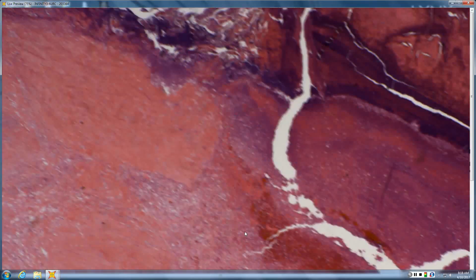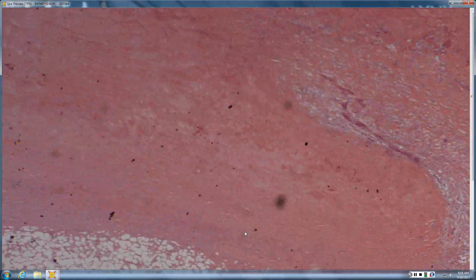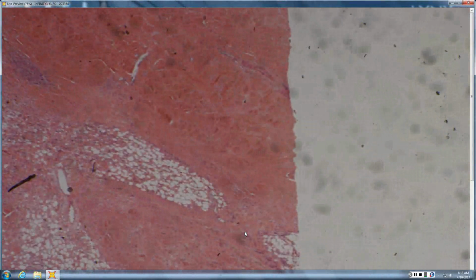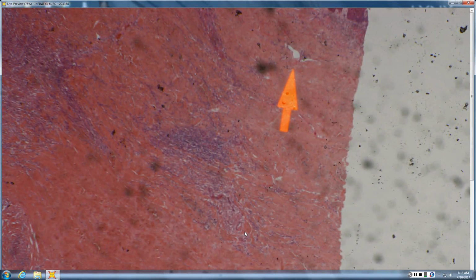So we've got a big ulcer, right? And then the question is, is anything in the background what may have caused the ulcer? So let's look at the adjacent skin. You've got a lot of sclerosis there, right? Maybe like just a stasis. Like stasis, is that cannonball-like angioplasia, or is that bizarre-shaped large ectatic vessel? Bizarre, large-shaped ectatic vessel. And why are the fibroblasts so big and gray and stellate? That is like a radiation. Like radiation, so ulcerated radiation dermatitis.